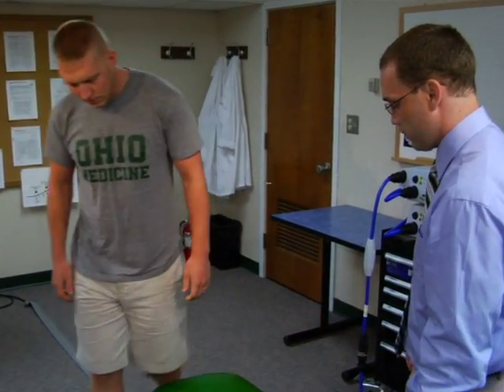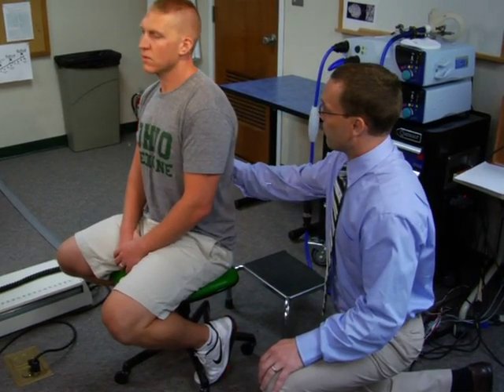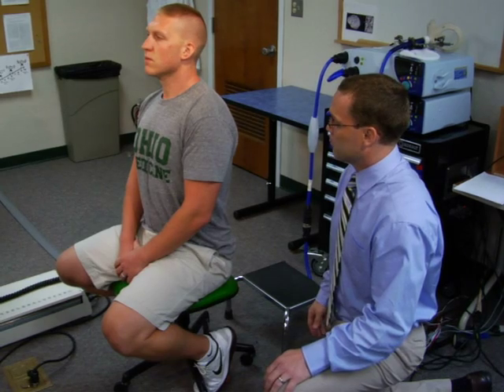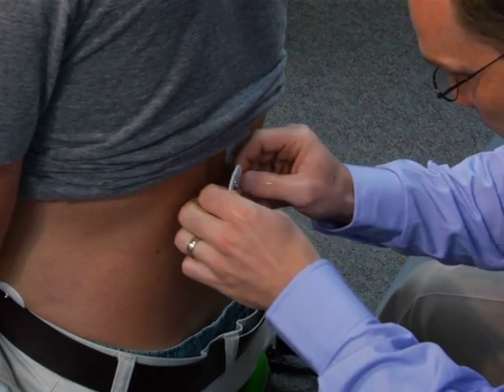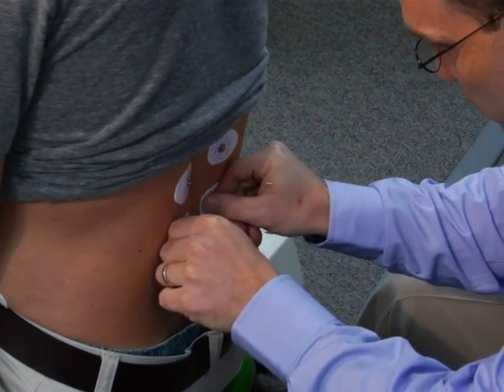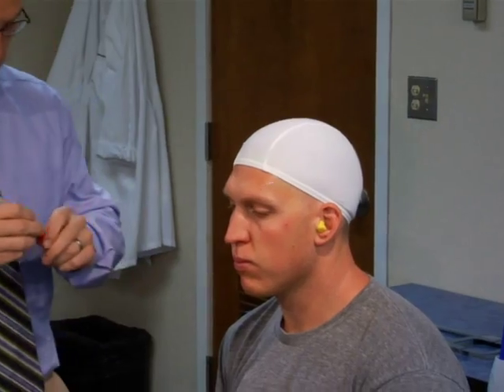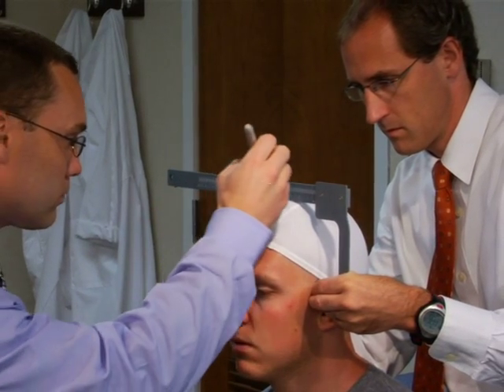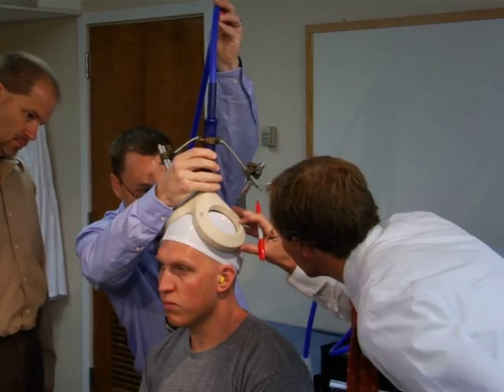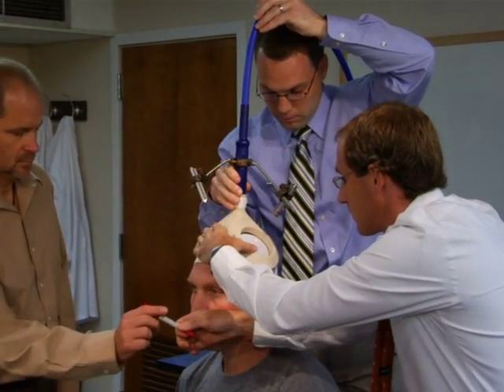Next, for the erector spinae muscle stimulation, have subjects sit in a swivel-based chair with the thigh at 90 degrees relative to the trunk, the lower leg at about 45 degrees relative to the thigh, the lumbar spine in a neutral upright posture, and the hands resting in the lap. For the erector spinae muscles, use an electrode arrangement located longitudinally over the muscles at the L3–L5 vertebral level on shaved and abraded skin. To locate the cortical erector spinae muscle stimulation location, use anthropometric measurements to identify the vertex of the skull — the intersection in the sagittal plane between the nasion and inion and the coronal plane between the tragus — and mark this as the vertex. To stimulate the erector spinae muscle, use a double-cone coil which has greater penetration depth and can reach the representation of these muscles deeper in the homunculus.